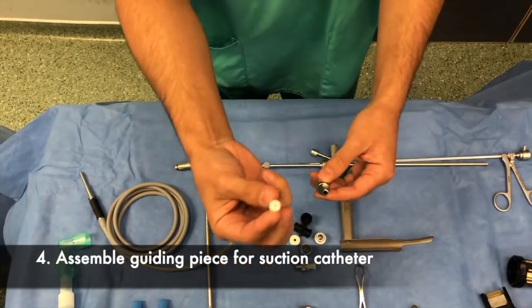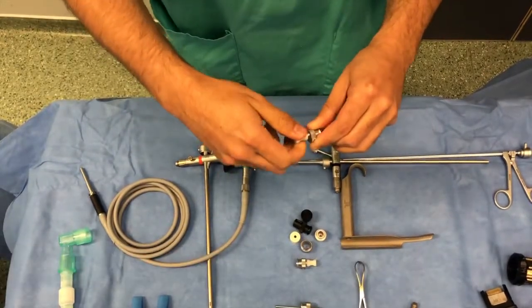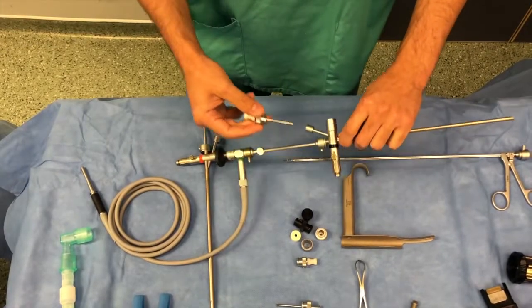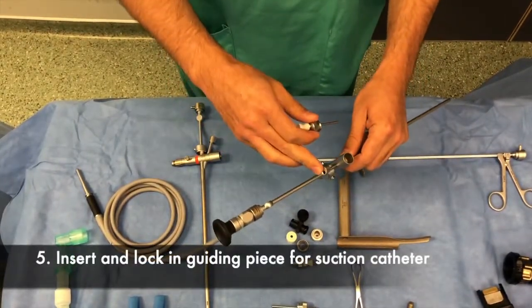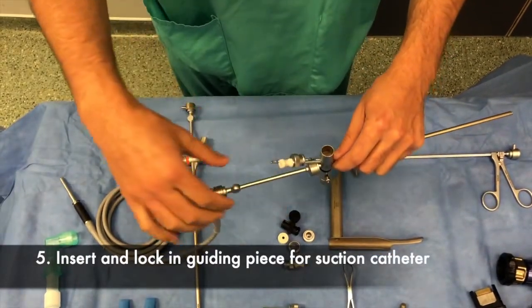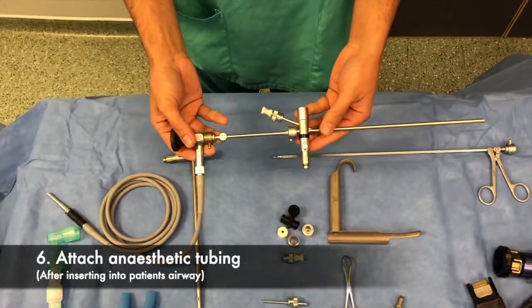Next, we attach the suction guide catheter by placing the rubber bung over the top, passing it into the slot as shown here. It is then passed in, rotated, and pushed down, locking it in place. A flexible suction catheter may then be passed through this to suction during the procedure.